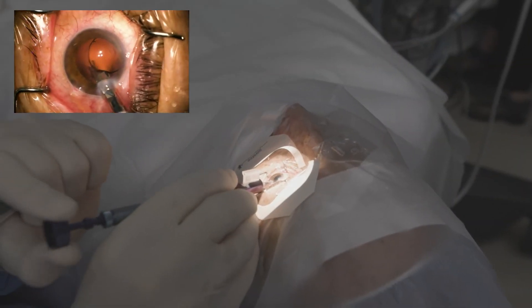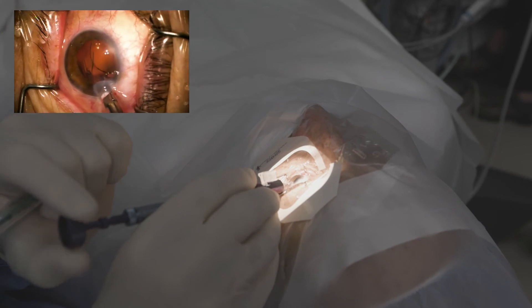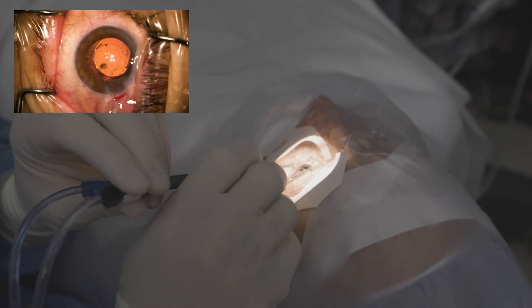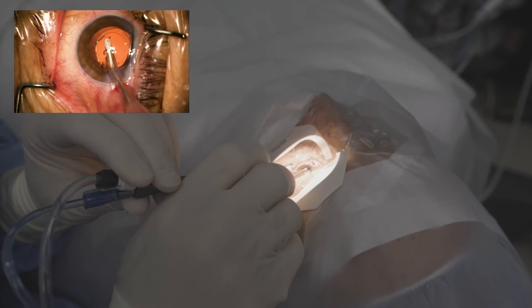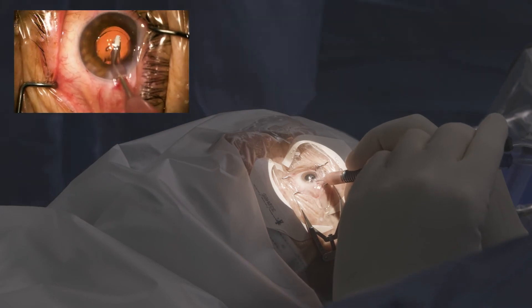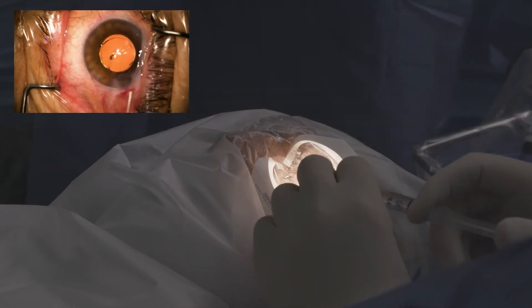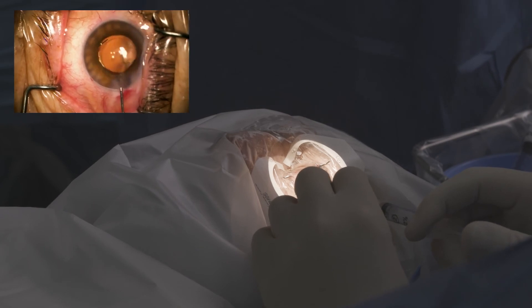There we go, and we have a controlled release right into the capsular bag. And even though it's a three-piece lens, we've got a slightly bigger incision — you can see slight egress around the wound. You're not getting as much vaulting of that lens. The iris wants to prolapse a little bit because the wound is not well sealed yet, but that lens stayed put because of that overlap.